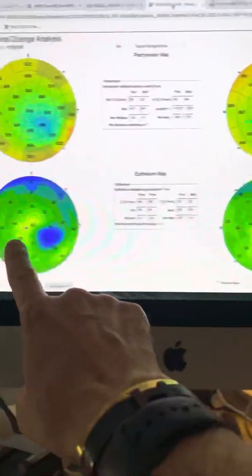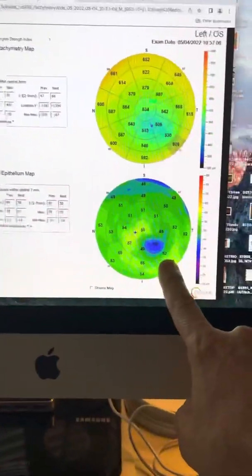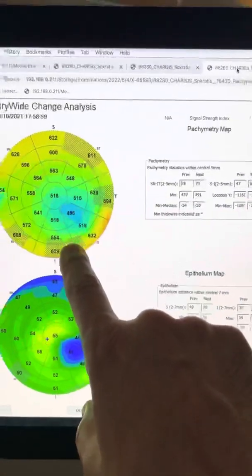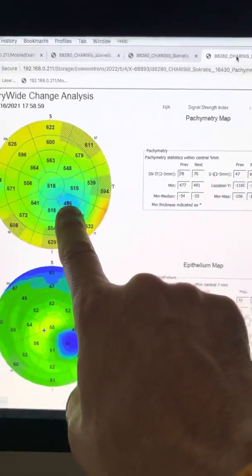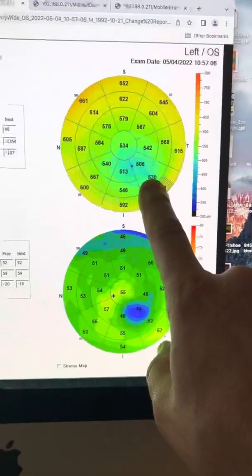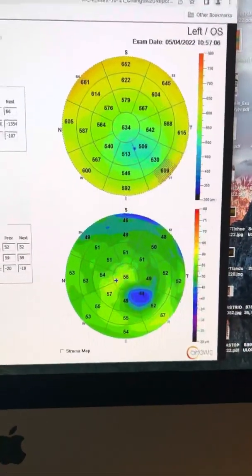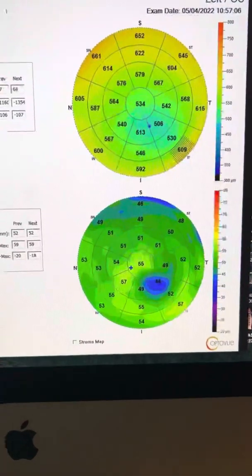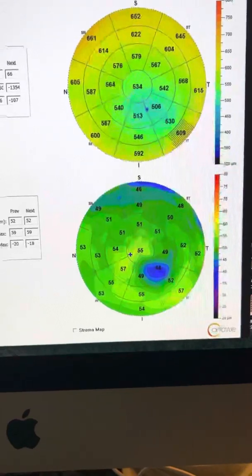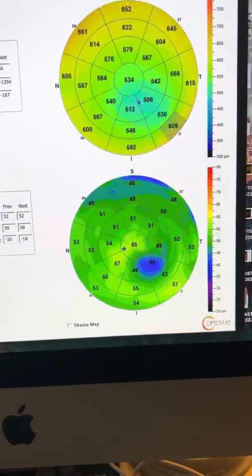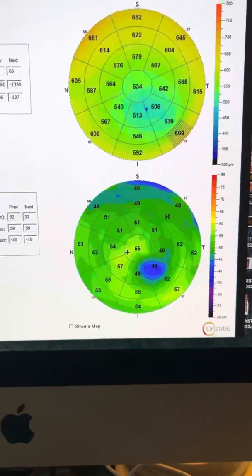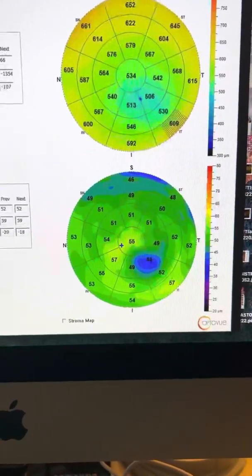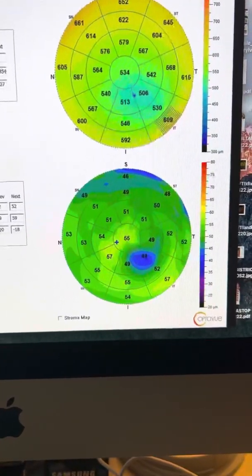So we can see the drastic improvement from last year to this year and also from cornea thickness 486 to minimum now 506. So 20 microns thickening in the left eye as well. So we're going back to the topography, the topography may appear a little bit steeper, but in essence, the cornea is thicker.